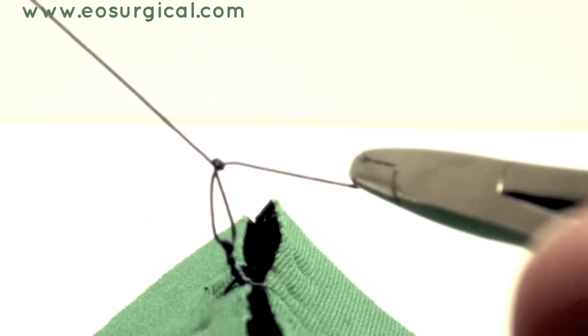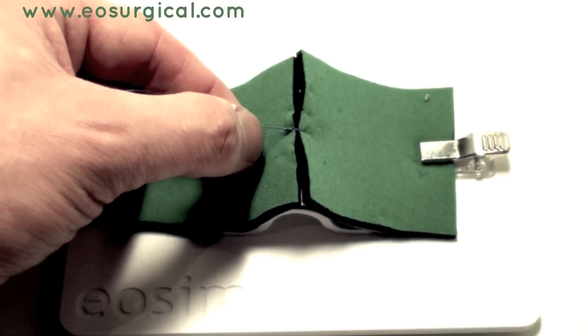Now, I've thrown quite a few sutures here to demonstrate this principle. Normally, an absorbable suture or braided suture would only require three or four throws.